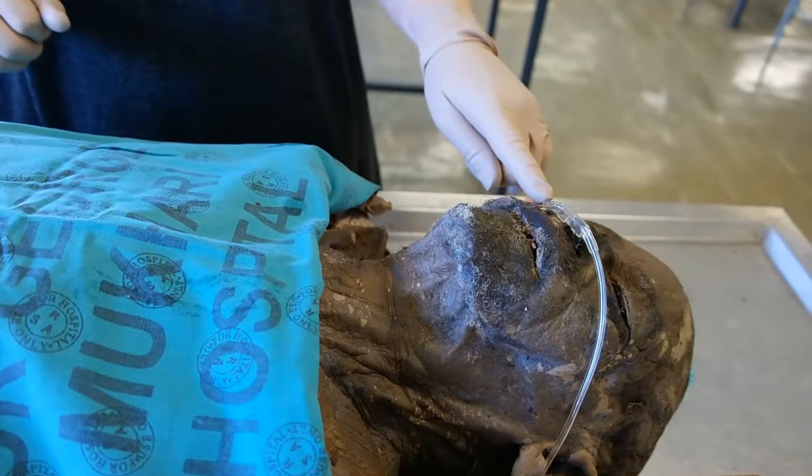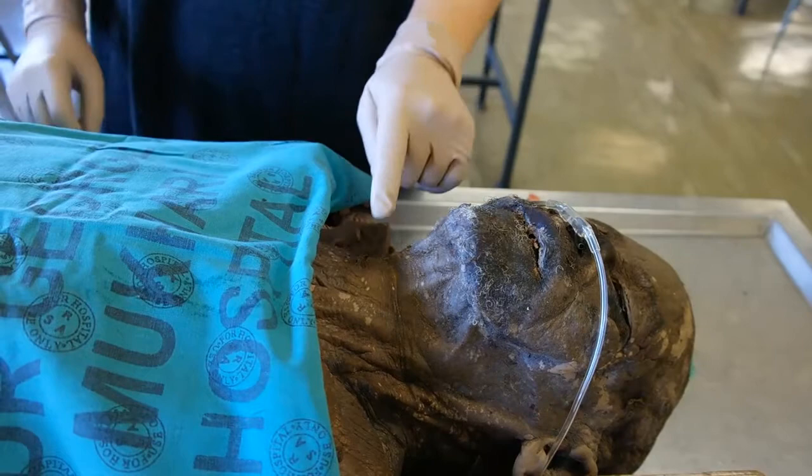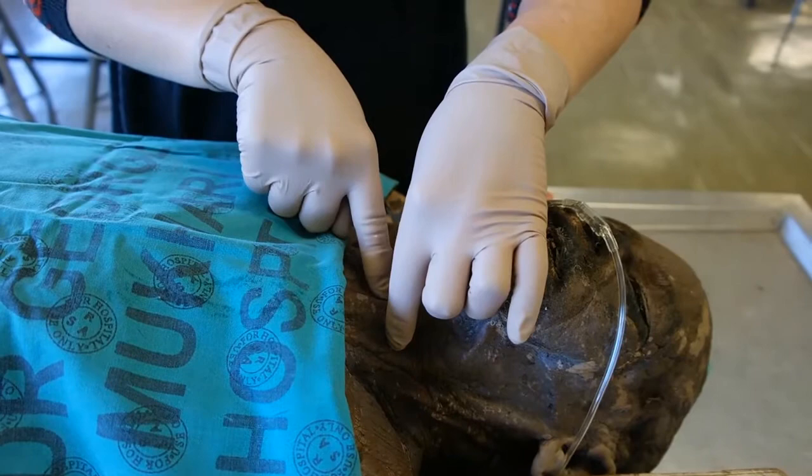Technique for the needle cricothyroidotomy. Continue to oxygenate the patient either with bag valve mask ventilation or by applying nasal prong oxygen for passive oxygenation. Clean the neck as for any sterile procedure. Apply local anesthetic if time permits.